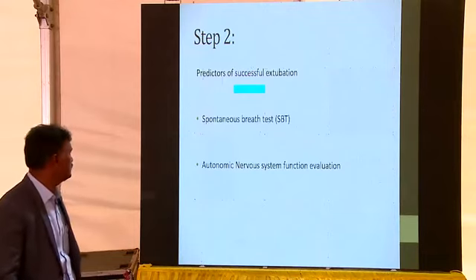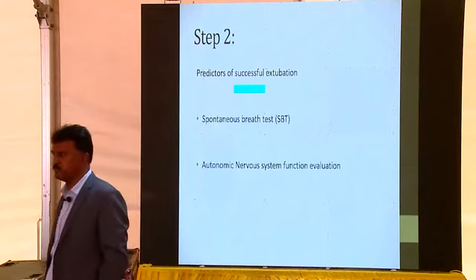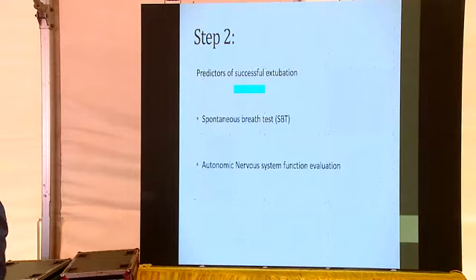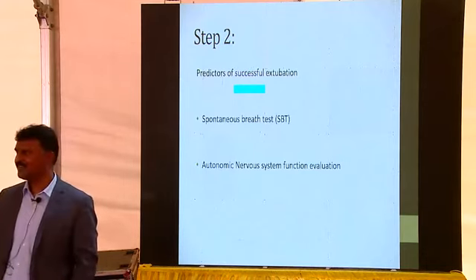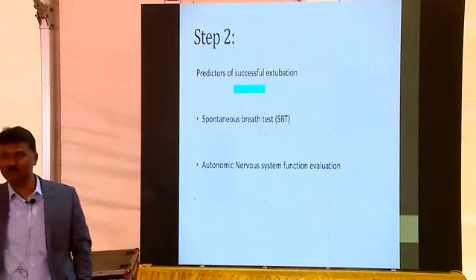question you ask yourself? Whether to do it or not. His ABGs are acceptable, easy breathing, spontaneous, SIMV breaths, we are only supporting. What other question do you ask yourself? And sometimes we say, leave it, not today, we will extubate in the morning, don't extubate today.